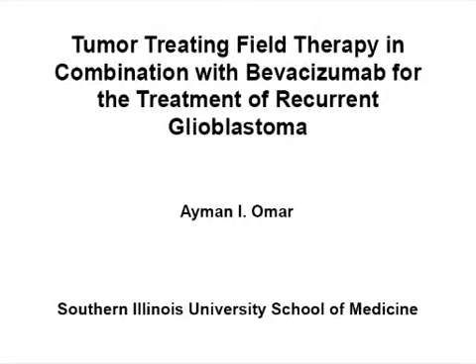The overall goal of this procedure is to develop a technique whereby tumor treating fields, or TTFields, are applied concurrently with Bevacizumab for the treatment of recurrent glioblastoma.